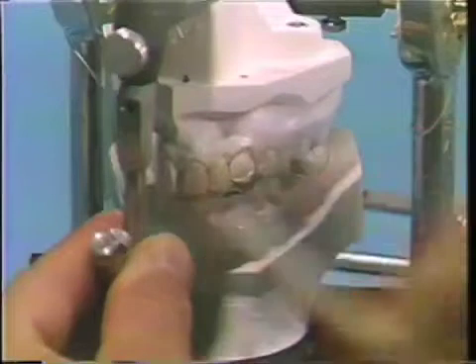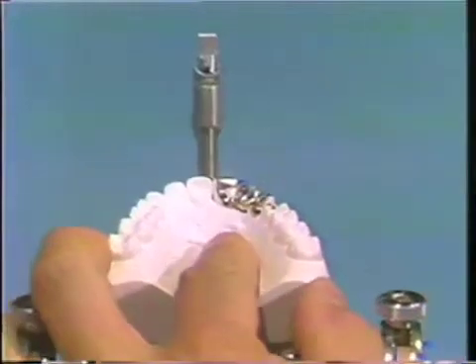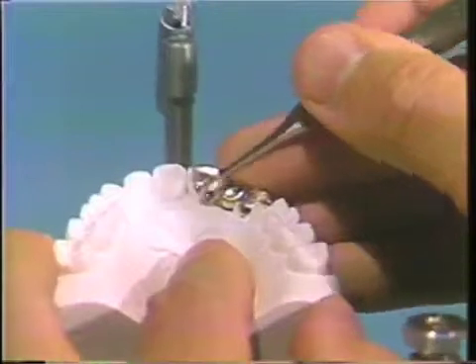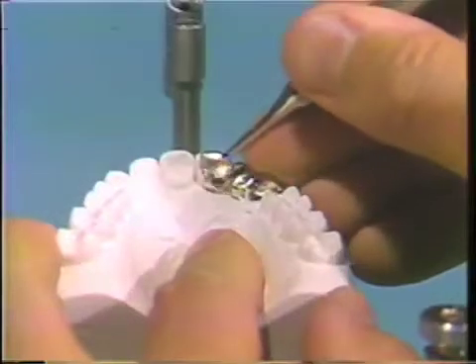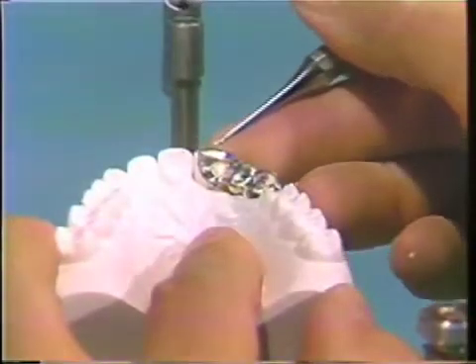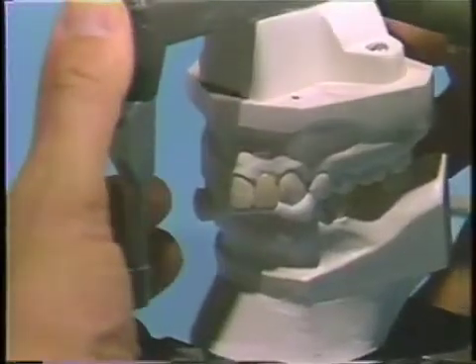When it is apparently seated and no more cement oozes out of the margins, some burnishing can be done on the gold margins. The pressure of the cement oozing out of the margins can open those margins slightly and they need to be burnished down for the final cementation check. The incisal edges are also burnished and then the patient is allowed to close on this for about 10 minutes.